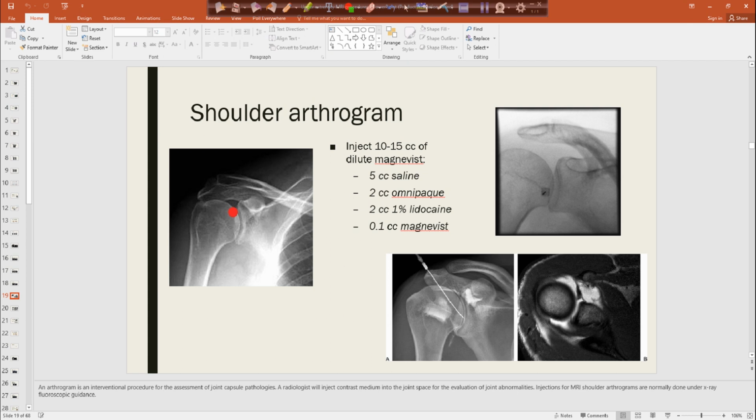So they were like, all right, make sure that they put the washcloth over their eyes, and the doctors are telling the techs, and the techs are like, we know these things, don't even remind us. But there is that concern that they're not going to be able to have the MR scan, even if they've actually been injected with the contrast.